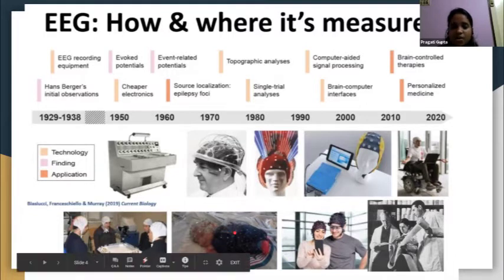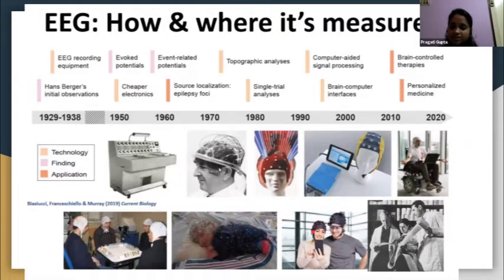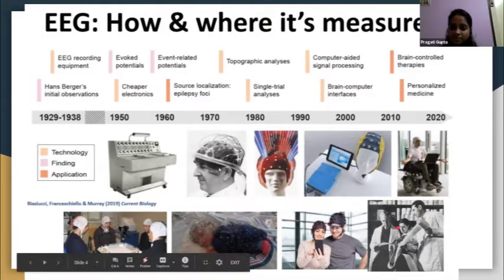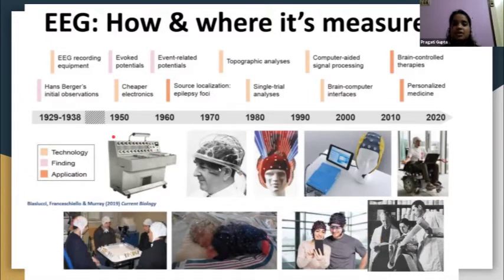And we can also record EEG from infants. We can also provide neurofeedback, the real-time feedback we can get from this type of technique. And this was the earliest way in which we used to record the EEG, from paper recording. And also with recent advancement, we have different equipment, different techniques.